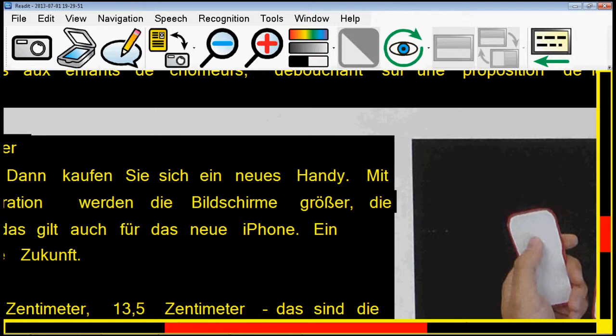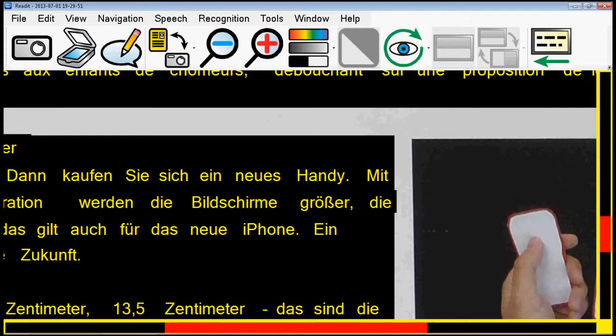So that just about wraps up the very quick demonstration of some of the new Scholar HD functions and some of the key features on the ReadIt software. The final version is planned to be released in August, so not too far away now. Thank you very much for watching. If you have any questions, please contact your local distributor for VisionAid International products, or please email us directly at sales@visionaid.com. Thanks for listening and watching.